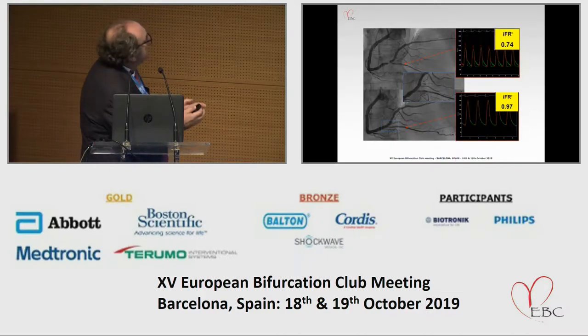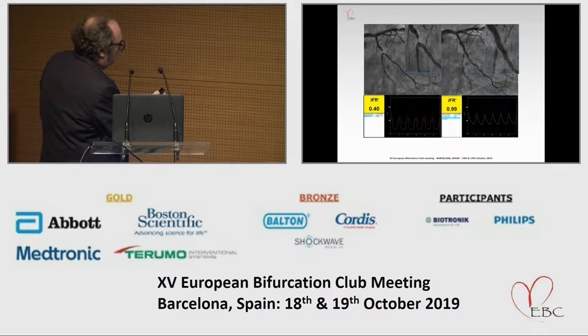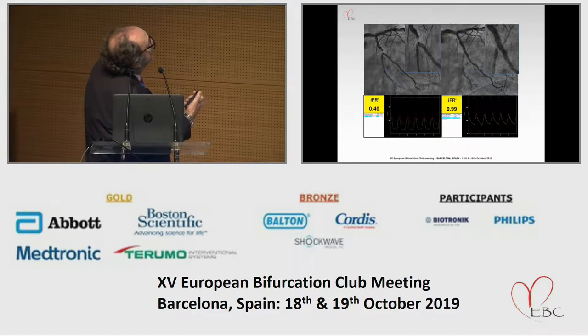An example of a patient with a bifurcation lesion, a Medina 100, after the main vessel stent implantation, you have some doubt at the level of the side branch. It's difficult to say if it is significant or not from an angiographic point of view, but according to the iFR, the flow is normal. Another example, in this case you can see a 1-1-1 Medina classification, probably after the main vessel stent implantation, a severe lesion occurs at the side branch, but the physiological study reveals almost normal flow. So in this case, we continue with treatment without side branch balloon dilation.